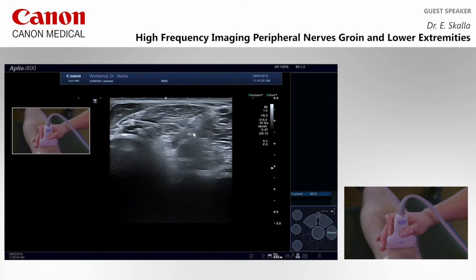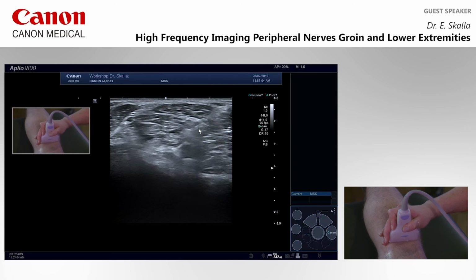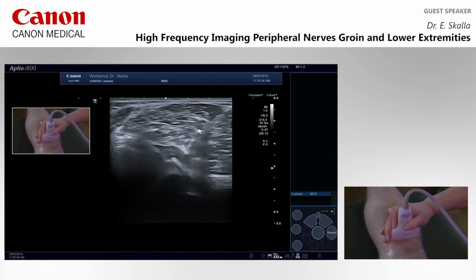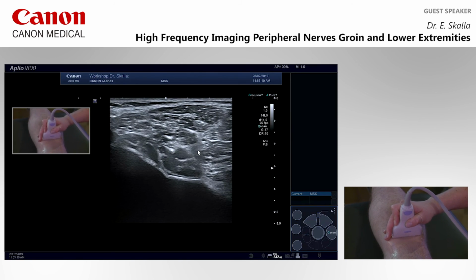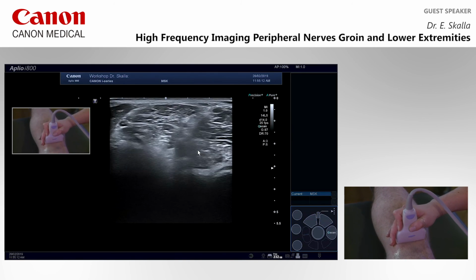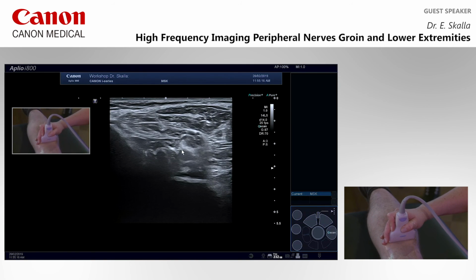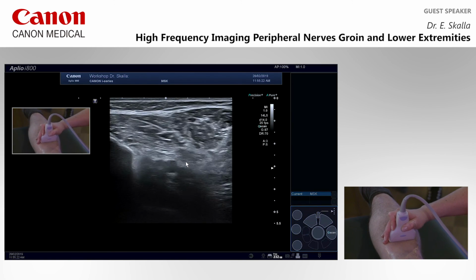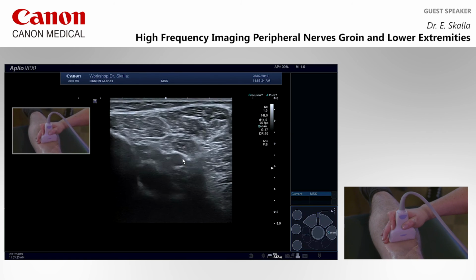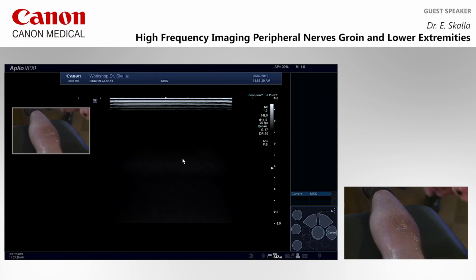It's descending here in this region from the center under the tendinous arch, and here it's really not that sharp. Then we can see it in the distal thigh, but here it's the artery, the pulsation of the artery, and here the tibial nerve lying beneath it. And this is the arch, and here it goes under this arch. Distally.